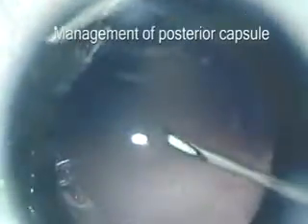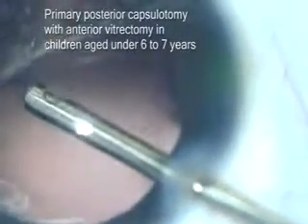Complete removal of the cortex helps to reduce post-operative inflammation and posterior capsule opacification. The posterior capsule is managed by adequate manual posterior continuous curvilinear capsulorhexis. It is recommended that primary posterior capsulotomy with anterior vitrectomy be performed for children under 6 to 7 years of age.